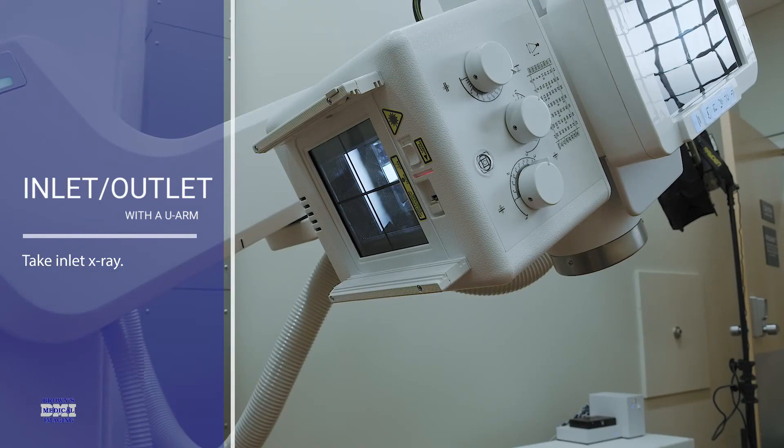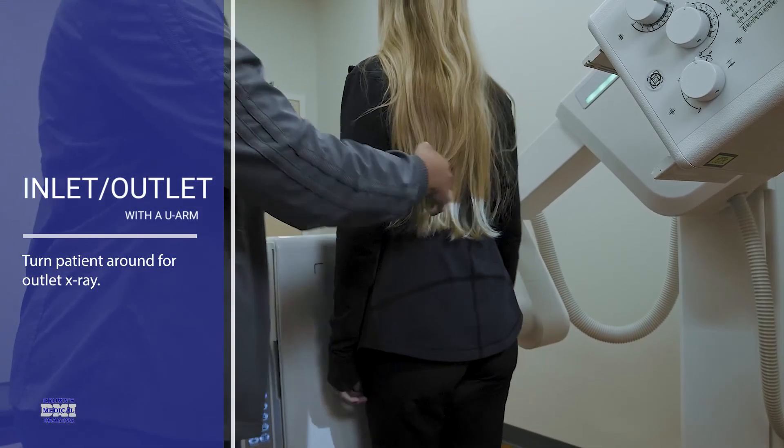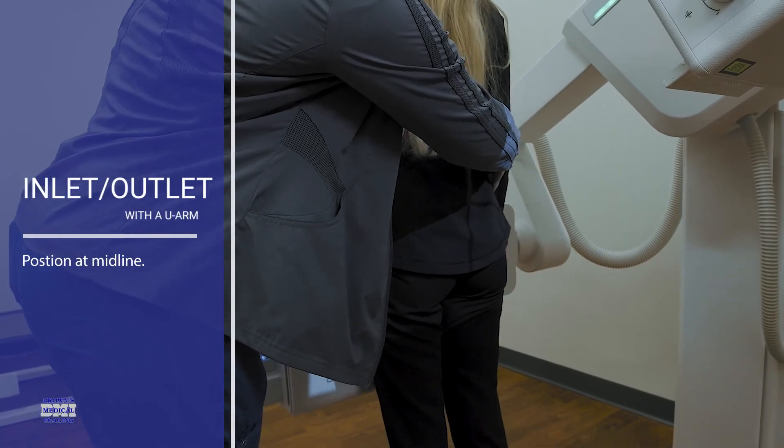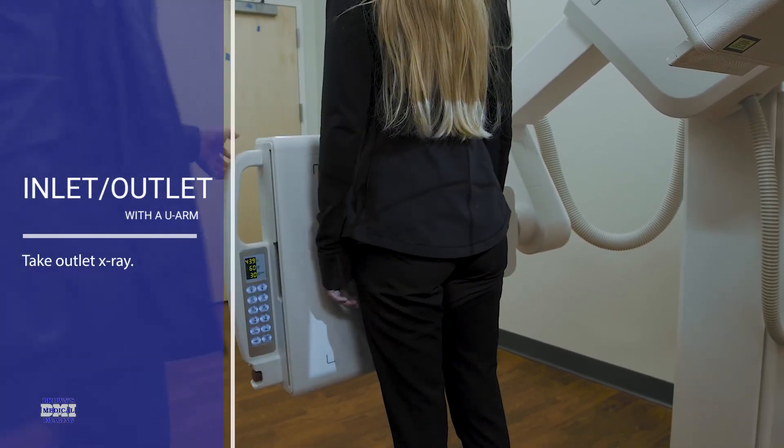To do the outlet, you just have the patient turn around and face the detector. Same positioning — make sure you're midline — and then you can take your outlet.